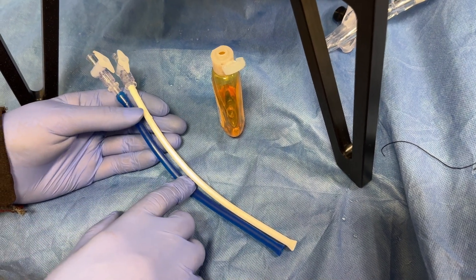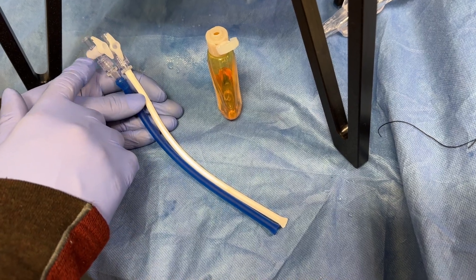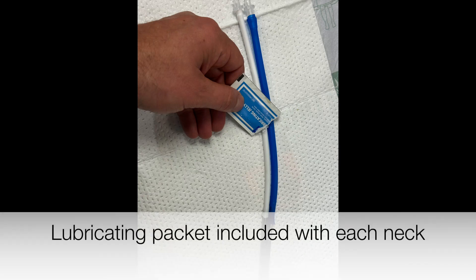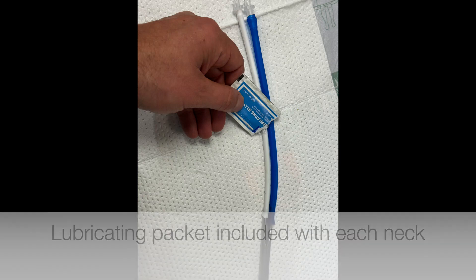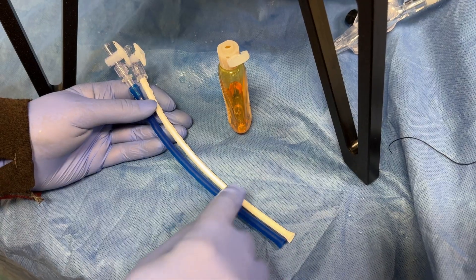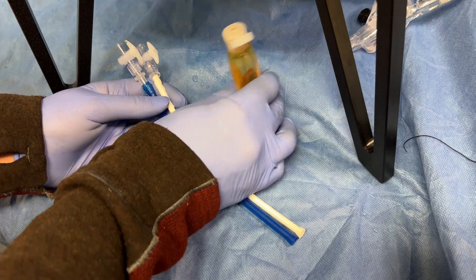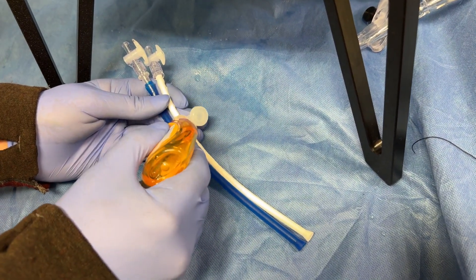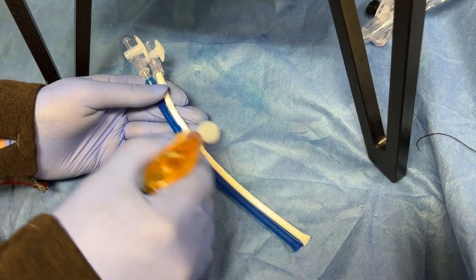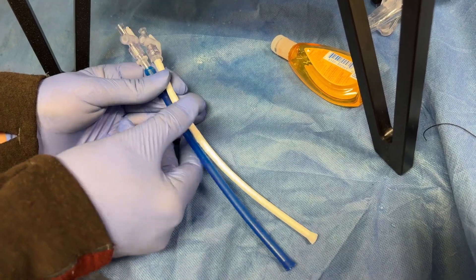First thing you want to do is load the vessels. You have the beveled end here, and you want to make sure the stopcocks are on the end of it and tightened. Sometimes it helps to put a little bit of lubricating jelly or baby soap on the vessel. You don't want the soap at the front here because that's what connects to the heart and it can cause it to come off. So if you put any on, just put a little bit more up in this area — you don't really need that much.